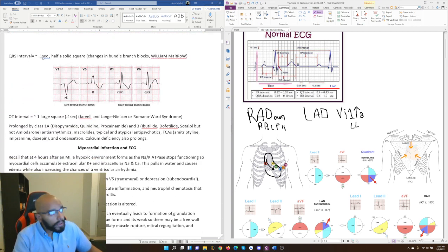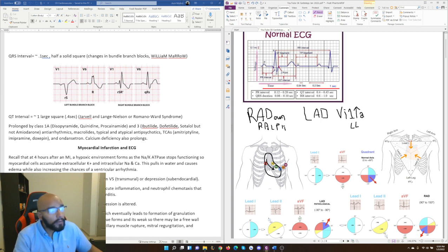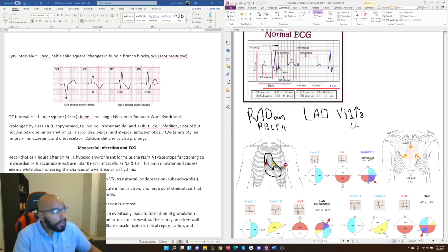The QRS interval is supposed to be 0.1 seconds — about half of a solid square. The QT interval is about one large square, roughly 0.4 seconds. The QT interval is very significant in conditions like torsades de pointes.